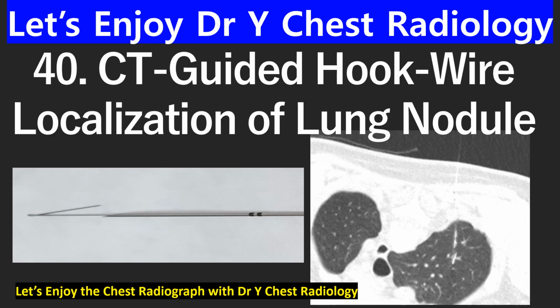Is everything okay? Today we'll talk about CT-guided hook wire localization of small lung nodule, session 40.